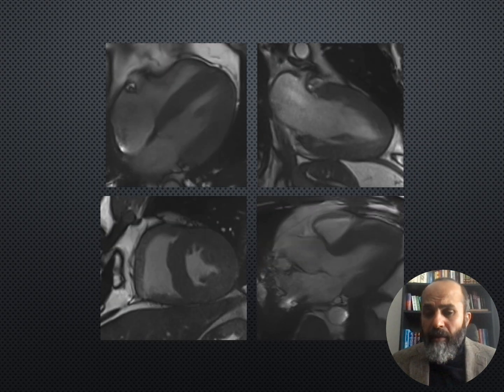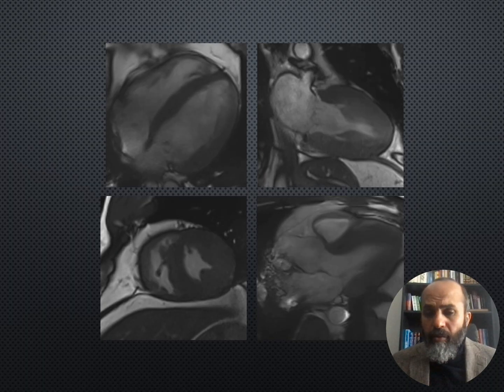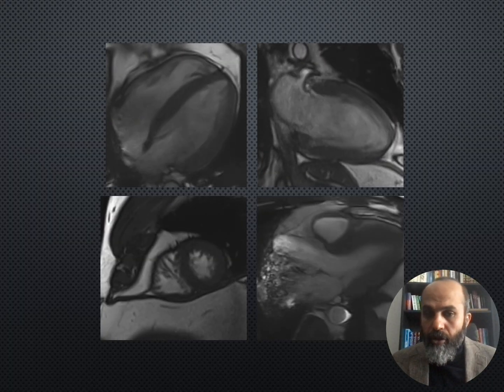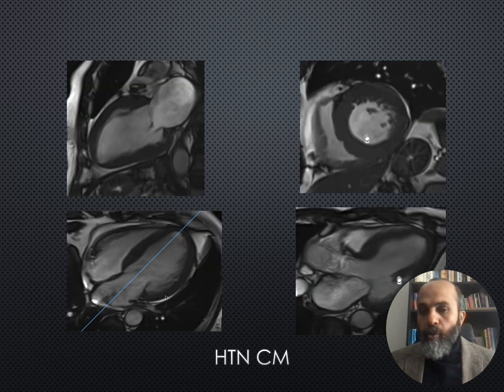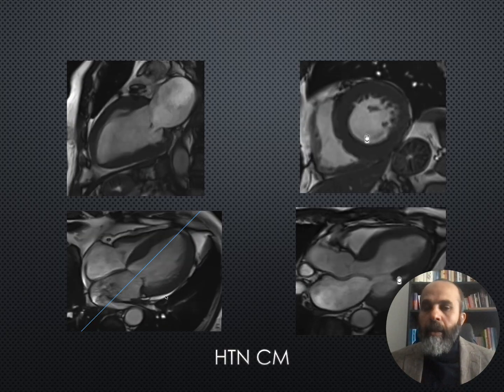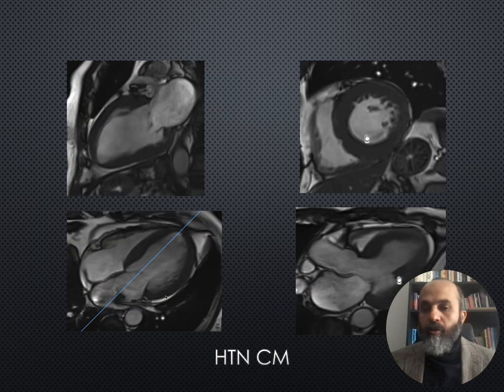Sometimes even the function might be on the lower side, so around 50% to 55% is accepted. However, it never goes to moderate dysfunction. Practicing strength sports, or a history of hypertension, which is another cause of symmetrical hypertrophy, sometimes associated with low function, sometimes with preserved function.